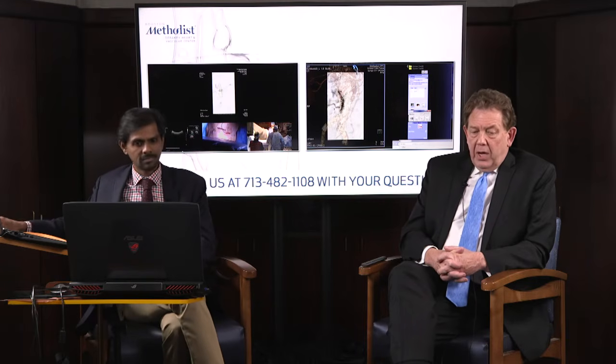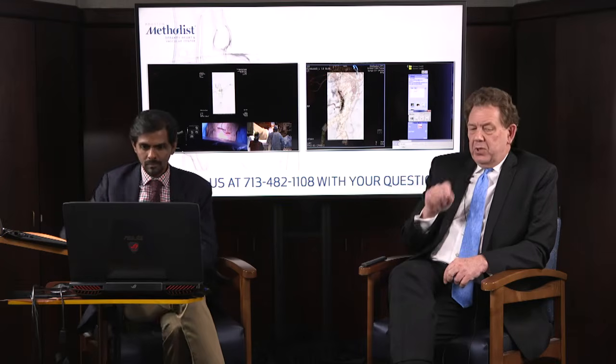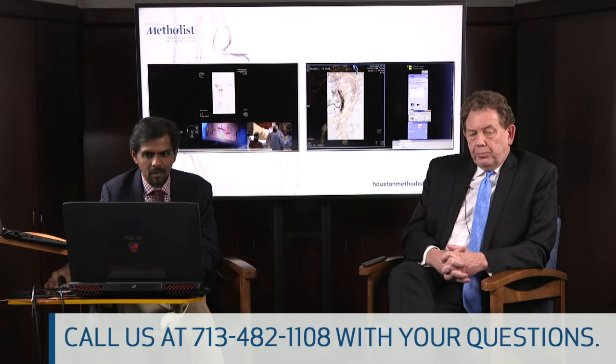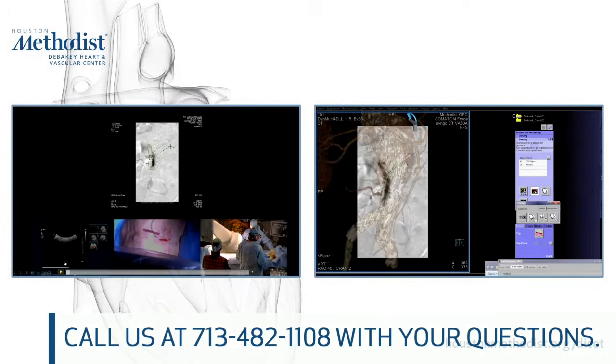713-482-1108. So Ponraj, on the left, we're looking at how we made an exposure, just a little incision, spread down to the aneurysm, stuck a needle in the aneurysm, and then put a sheath inside the aneurysm sac using that guidance system. Yep. And what you're going to see is, on the left image is what a surgeon sees, on the right is the 3D fusion, 2D 3D fusion.